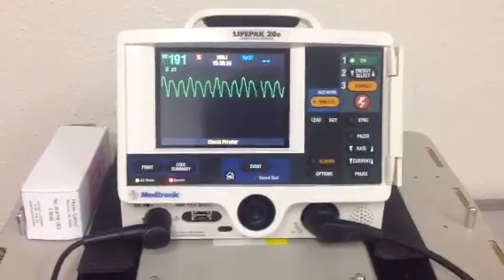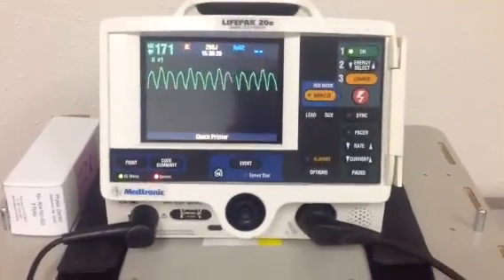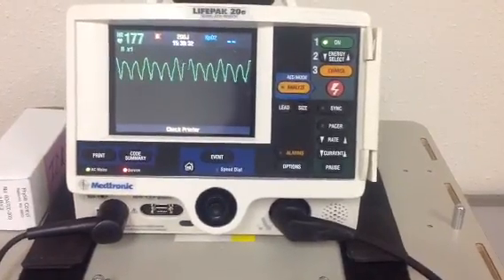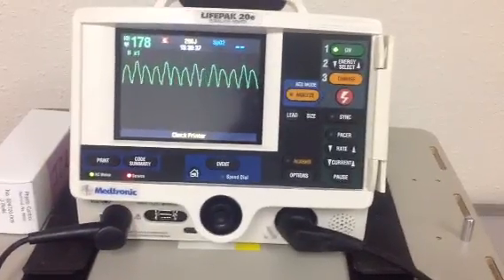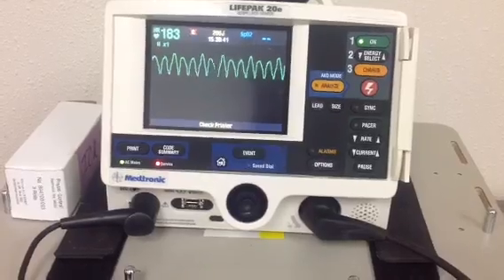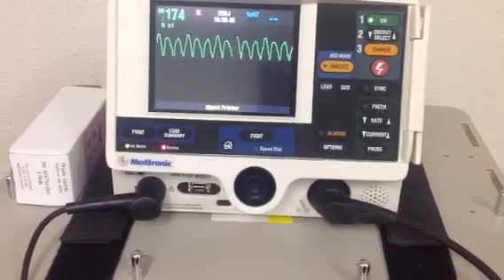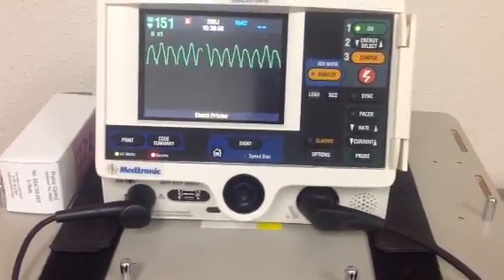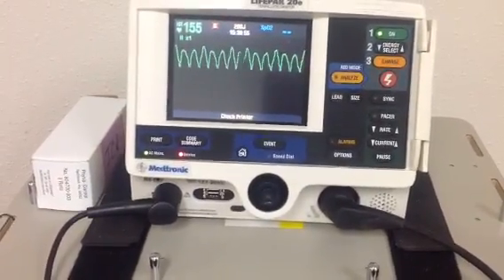He's sitting up and talking to us, just telling us he's got a fluttering in his chest. So we want to immediately put some O2 on this guy and we want to go to work on this rhythm. All of a sudden he tells us he's got crushing chest pain. You check his blood pressure — now his blood pressure is 85 over 40. It has gone down and he is symptomatic, so we now need to cardiovert this patient because he is unstable.